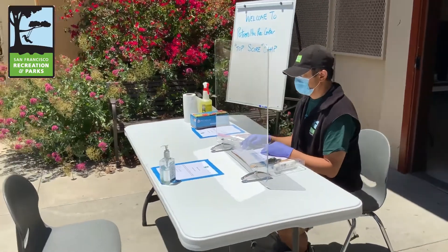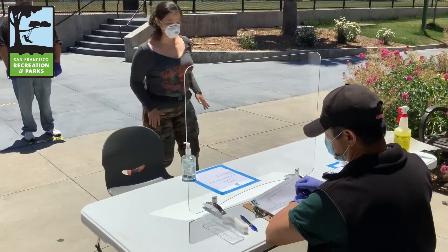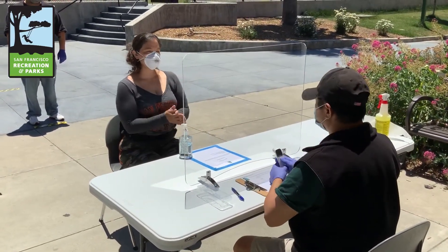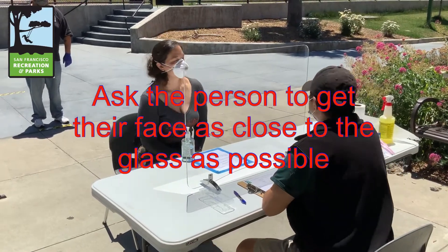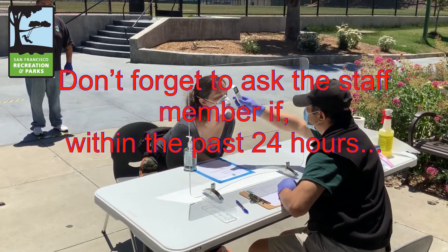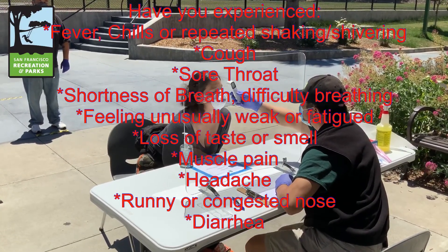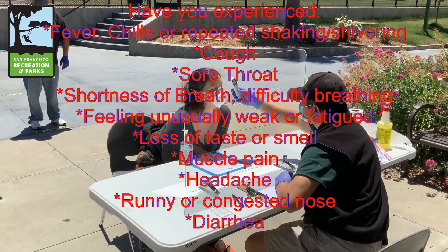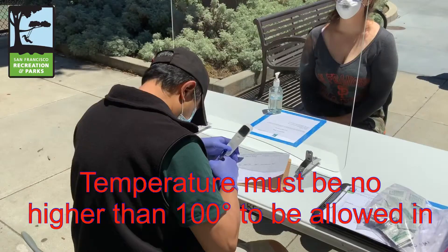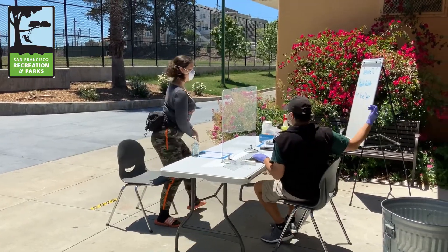Thumbs up! Looks like Jimmy is eagerly waiting his first check-in. Look, it's a staff member! Jimmy starts by asking the staff member to place their head close to the plexiglass while he checks their temperature. Looks like her temperature is under 100 degrees — Jimmy gives her the thumbs up and she's good to go.